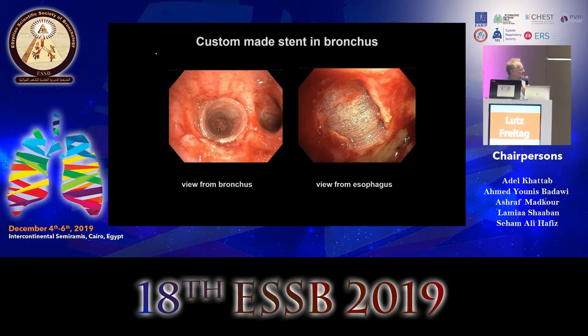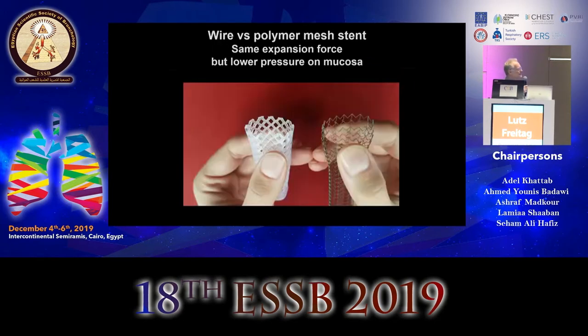And this is after implantation. On the left side, you see the view from the bronchus. On the right side, you see the view from the esophagus, and you cannot see the sealing rings. So the symptoms stopped. The patient died later on of brain metastasis, but it's a proof that it's doable. Let me talk a little bit more about biomechanics.